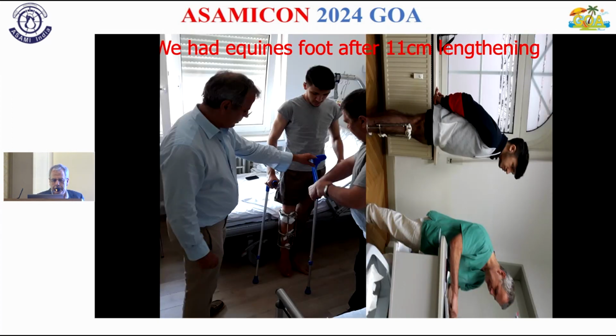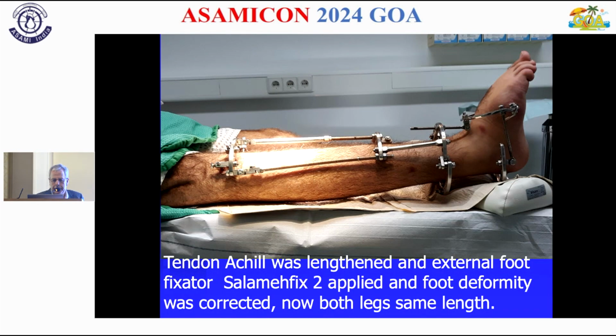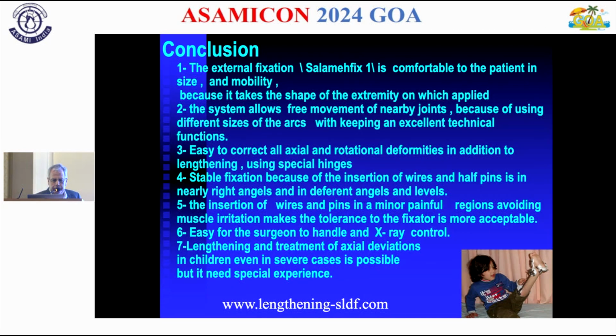And this is a patient in my office during the treatment. And this is a picture during the treatment. We also fixed the ankle joint and corrected the leg and the ankle at the same time. In conclusion, this external fixation system is comfortable to the patient.